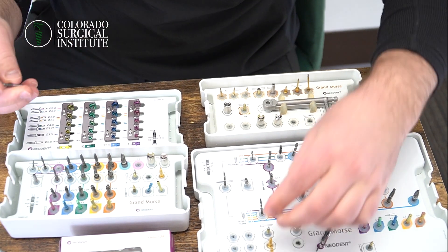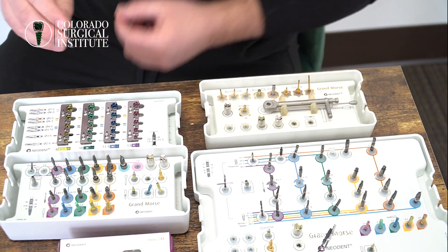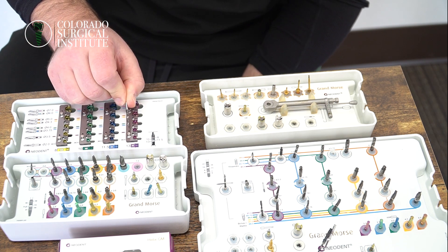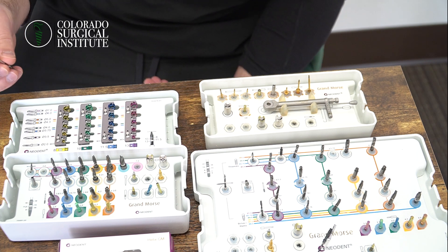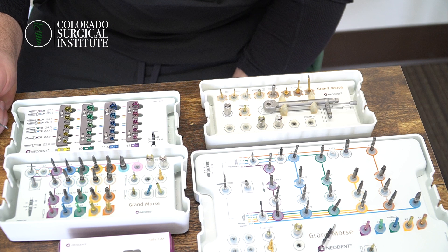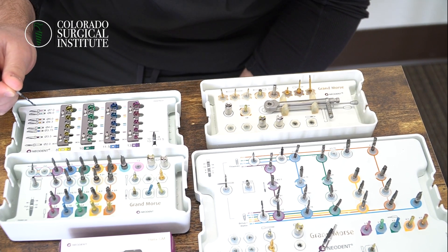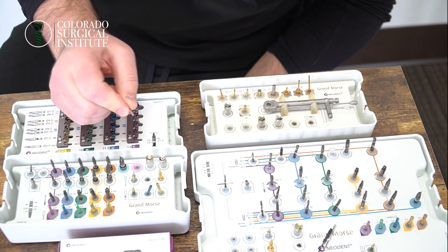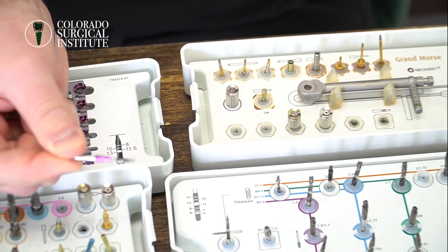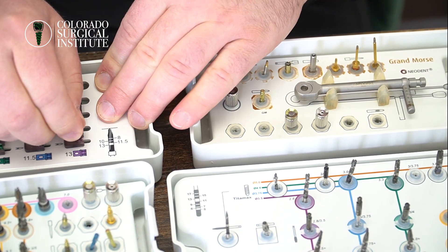How the Neodent control stop kit works is you have one burr and you can pick up a guide sleeve. The guide sleeves are broken up by sizes: 8 millimeter drill stop, 10 millimeter drill stop, 11.5, and a 13. When I'm doing surgery, I like to eliminate worrying about the depth of implant placement, and instead focus more on the angulation of your osteotomy. You basically stick the burr in, hear a little click, drag it to the side, and it now has the 13 millimeter stopper on it. This is a super helpful tool — we use it every day.